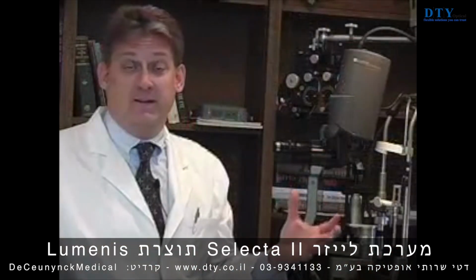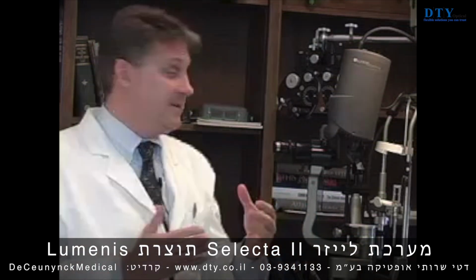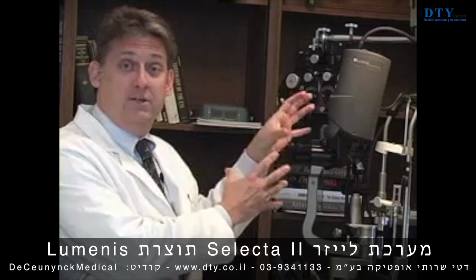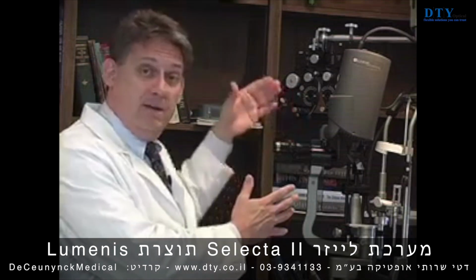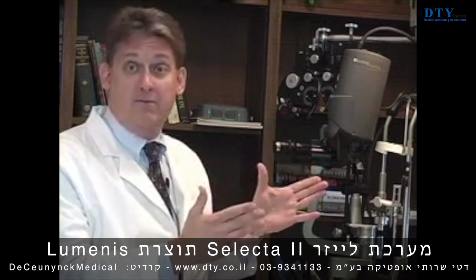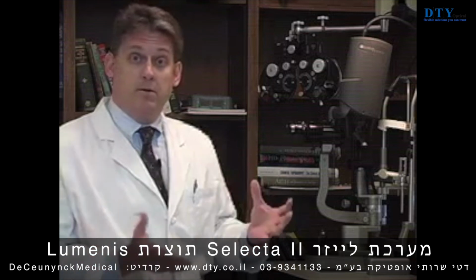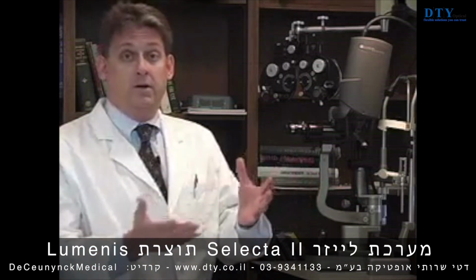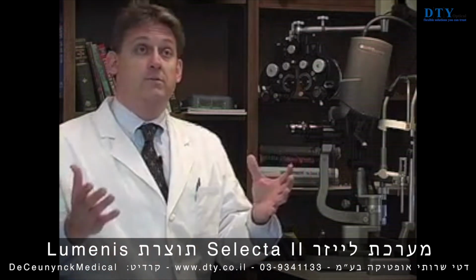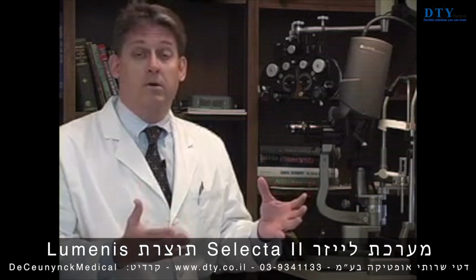Here in the office in downtown San Francisco, every square inch of our office is precious. And this technology allows us to hook up the actual laser unit to our slit lamp. The cable then goes off to the power source, and it allows us to use an exam lane for multiple purposes. A great piece of technology. It's portable, it's compact, we can hook it onto our slit lamp, or at the hospital we have a duet unit which has both a Q-switched YAG as well as the SLT mode.